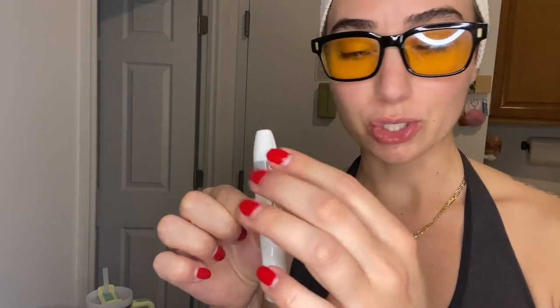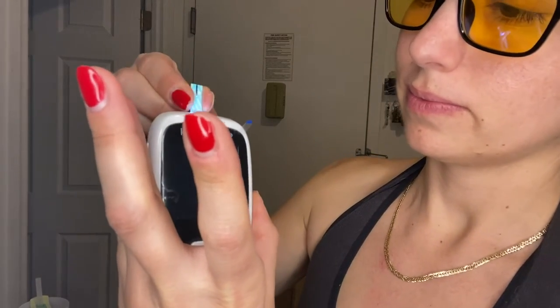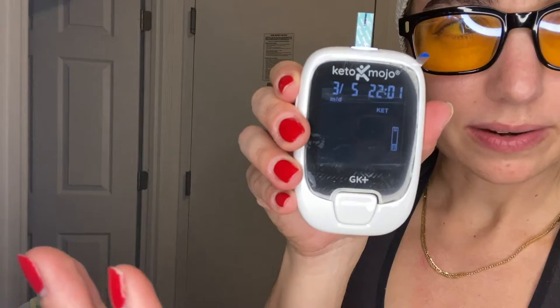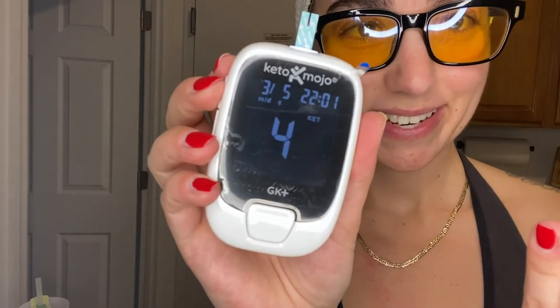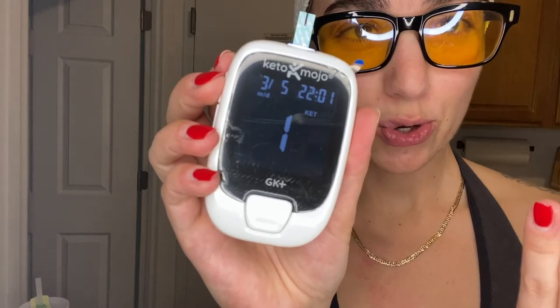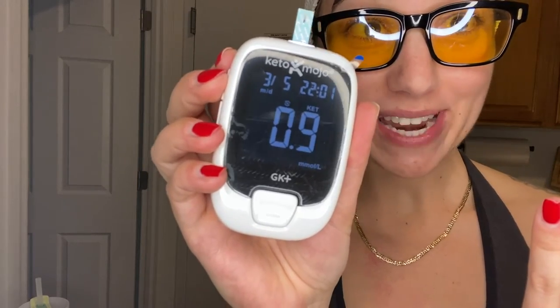Actually that wasn't that bad! I got a little bit of blood going. There's my blood and I'm going to put this in. Okay, this is it — three, two, one... 0.9! Is that ketosis? I think that's good!